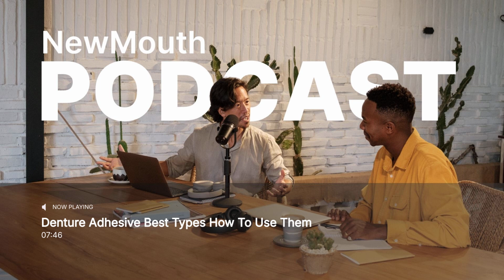First things first, maybe just the basics. What exactly is this stuff? Simply put, it's a temporary solution to help dentures fit more securely, especially while someone is waiting for adjustments or a new set of dentures. Gotcha. So not really meant to be a long-term permanent fix. Why is that? Well, it's natural. Over time, the bony ridges in your mouth change slightly, and that can make the dentures a bit looser than they used to be. Adhesive just kind of helps fill in that gap, so to speak.